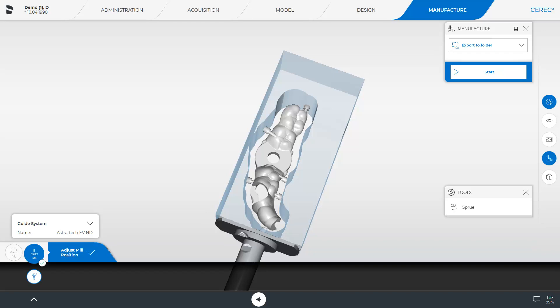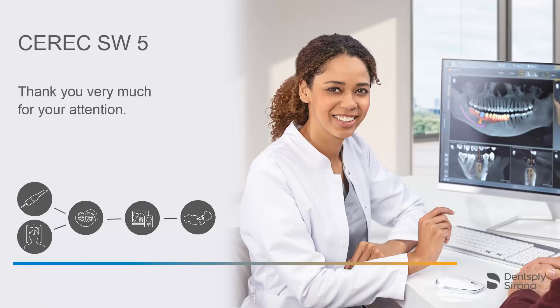Since in our case, no milling unit is connected, we are only offered the option to export the guide data to a folder. Thank you very much for your attention. We would like to wish you every success when working with CEREC.